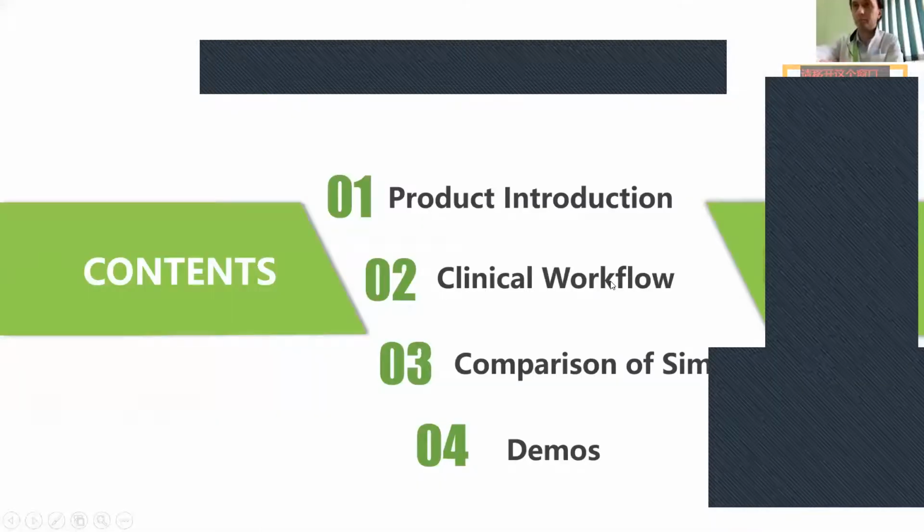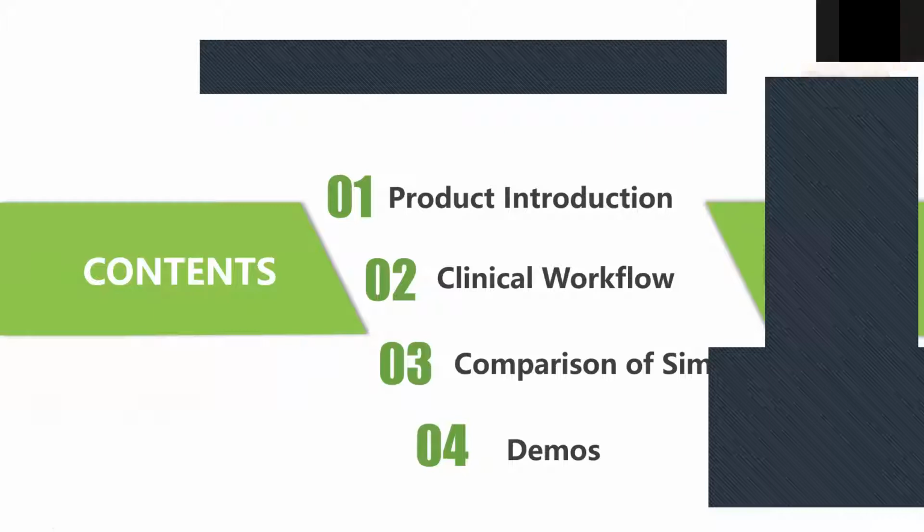Okay, my presentation will include 4 parts. The first one is about our product introduction, and the second is about the clinical workflow. And I will introduce the comparison of similar products. And the 4th part will be the demos of our product.